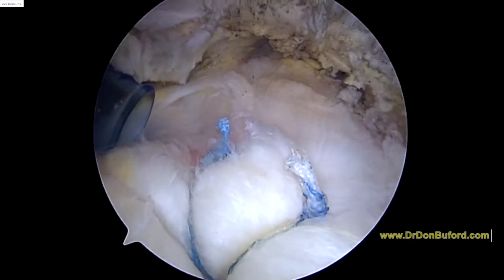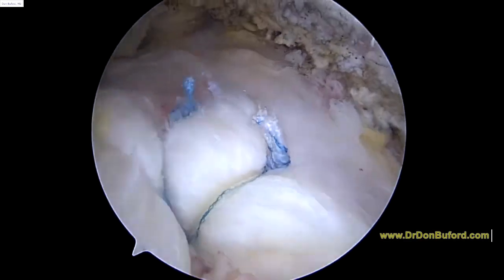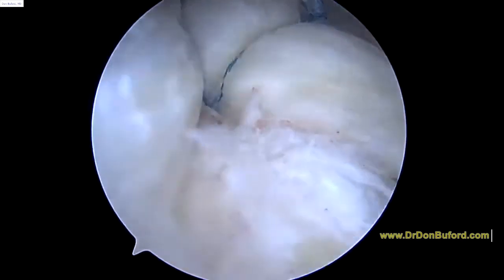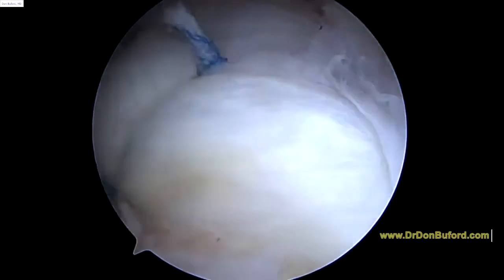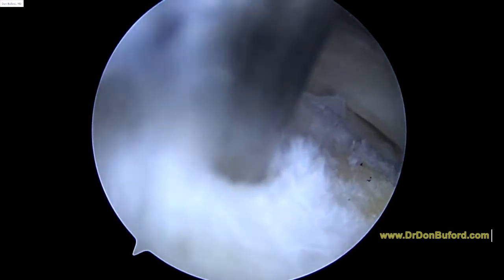We've got all three tied — that looks pretty good. You can see how it's spread out; the sutures are spread out. As I rotate your shoulder, that's keeping your cuff down. We've got one more last little trick up our sleeve. We're going to take a little punch and use this to access the bone marrow — we're going to make some little vascular channels in the bone. This will release some of the bone marrow elements including stem cells and other growth factors.